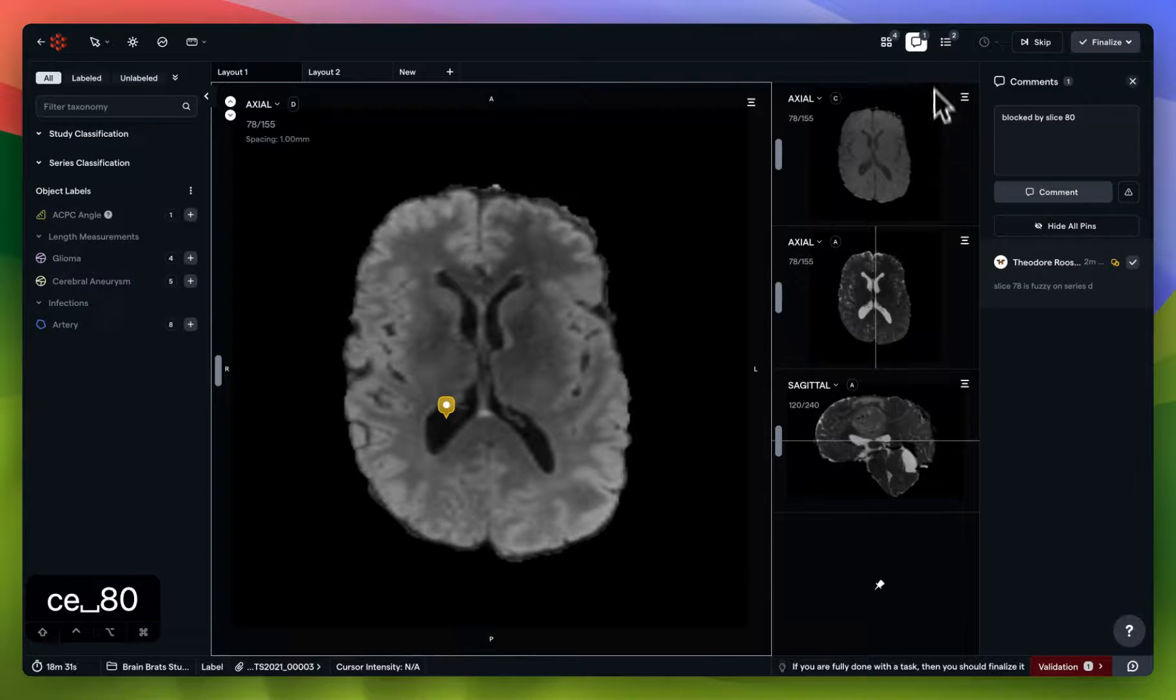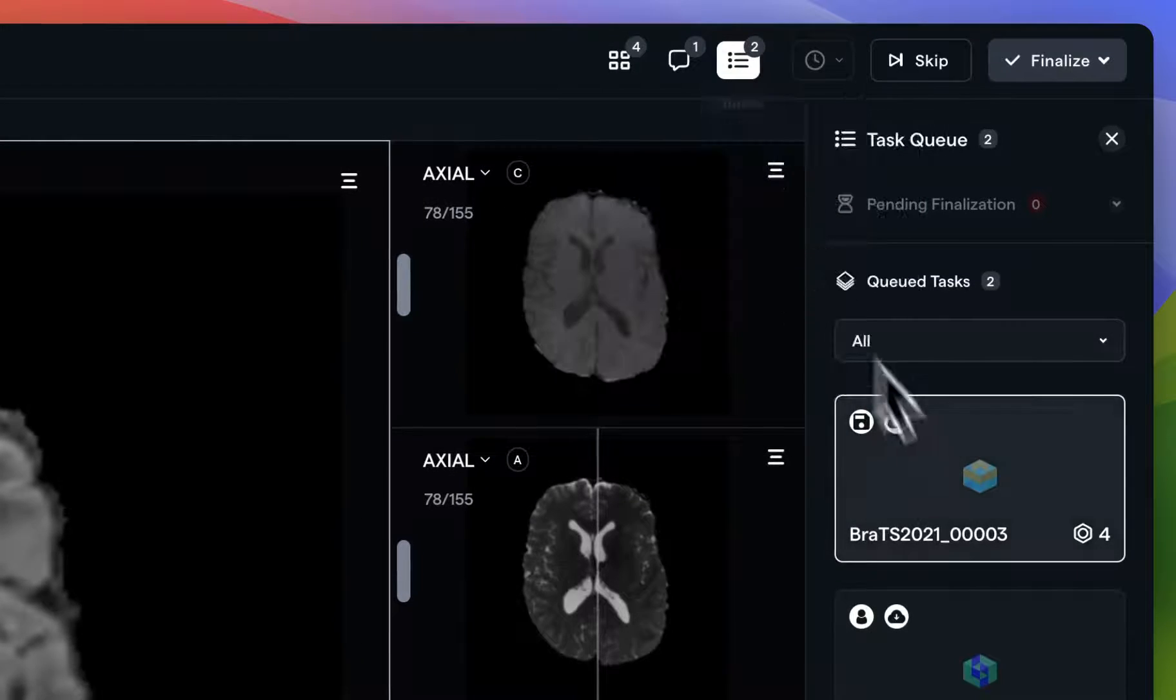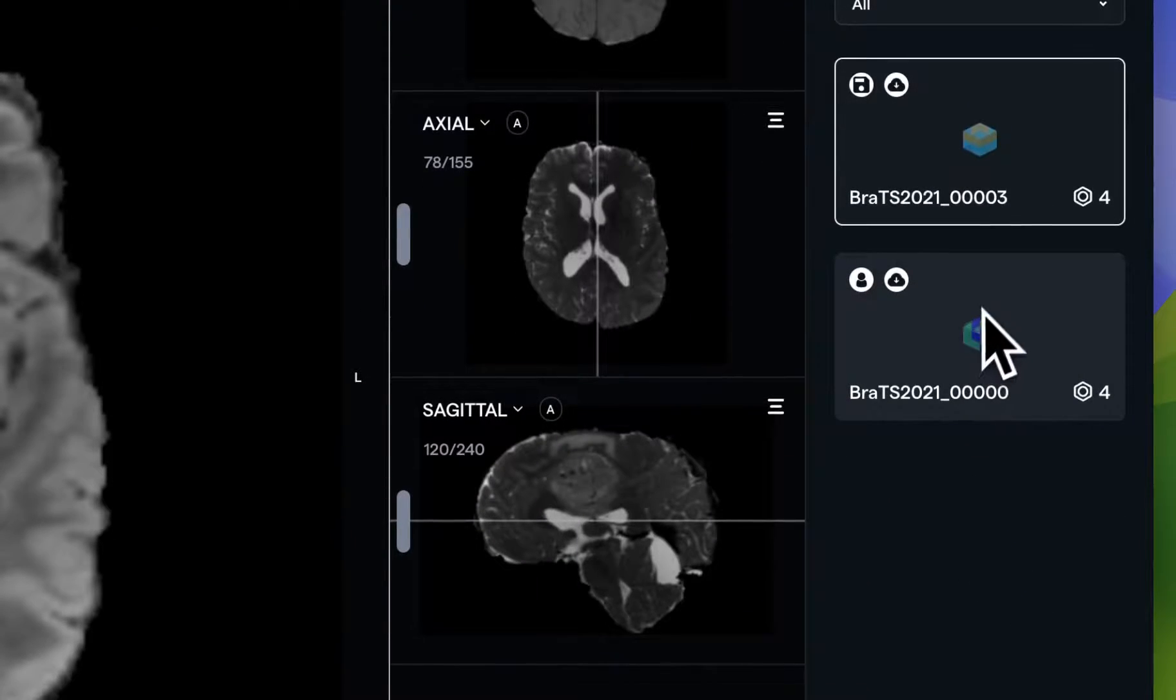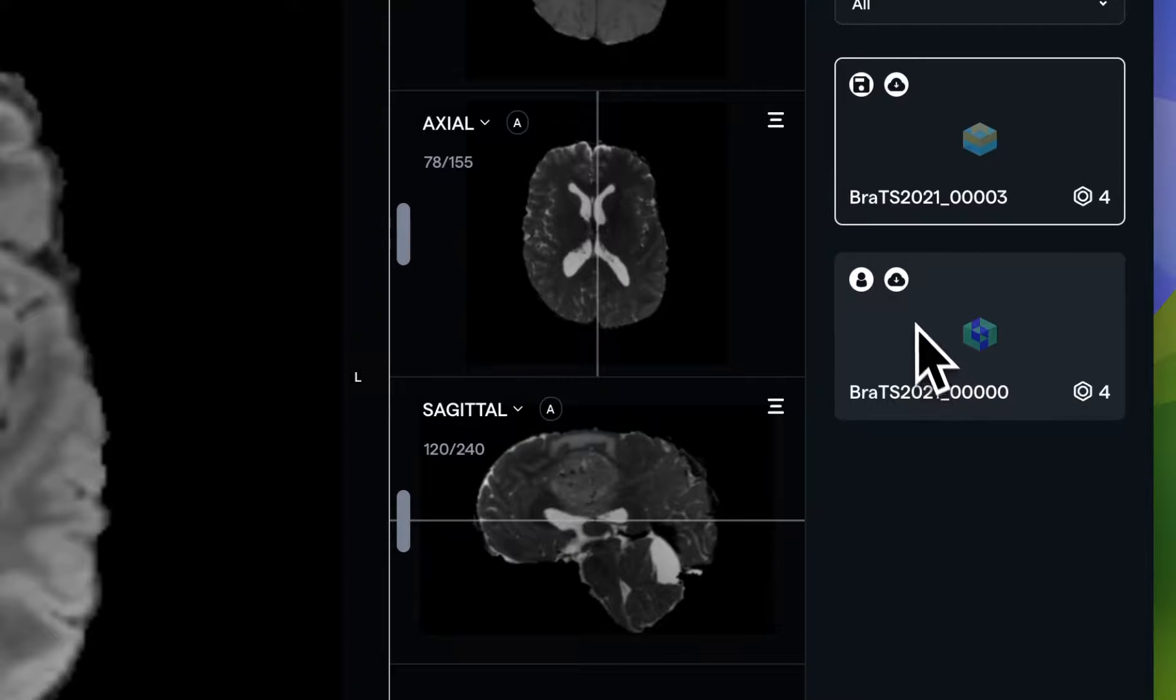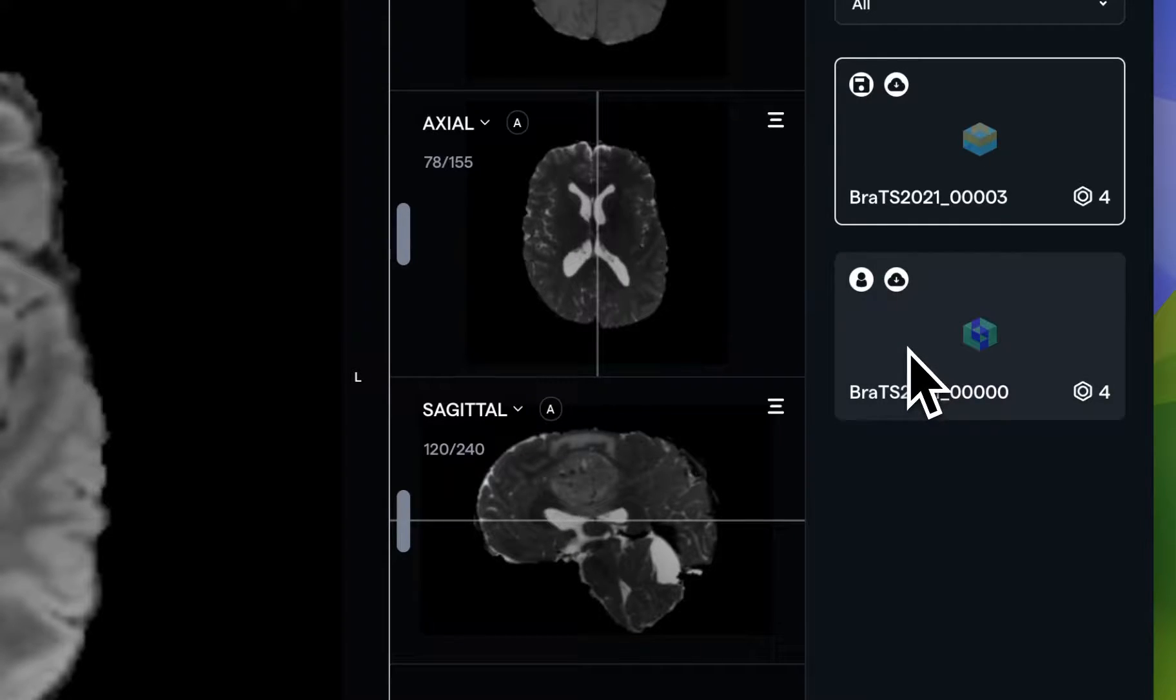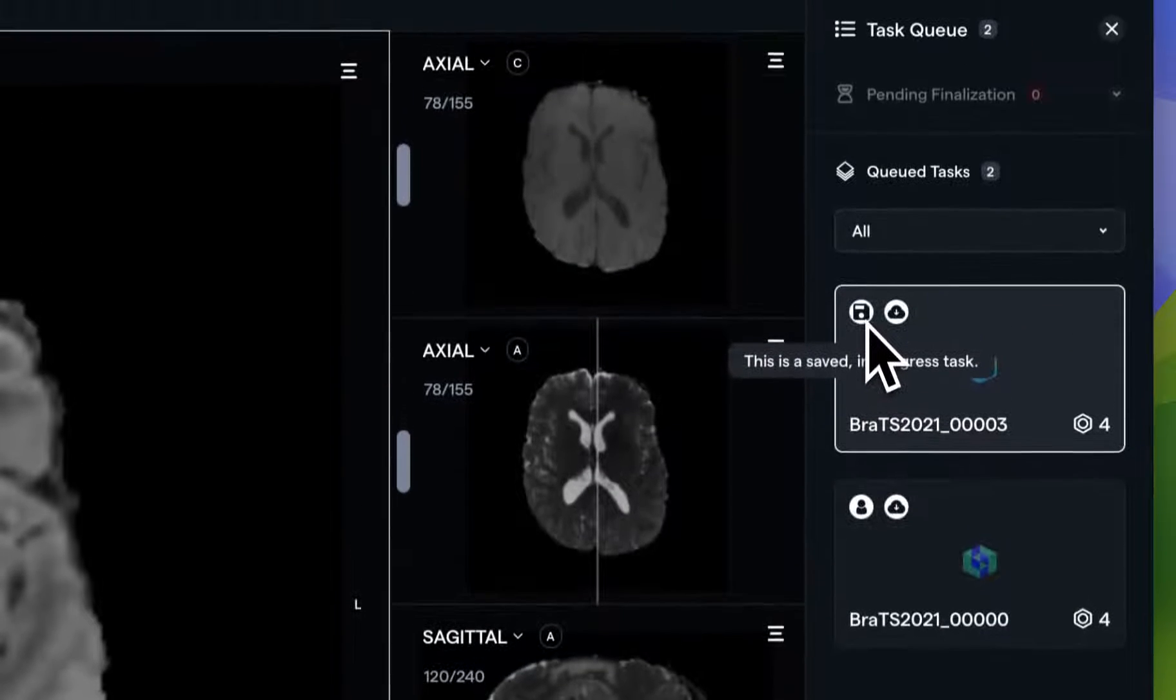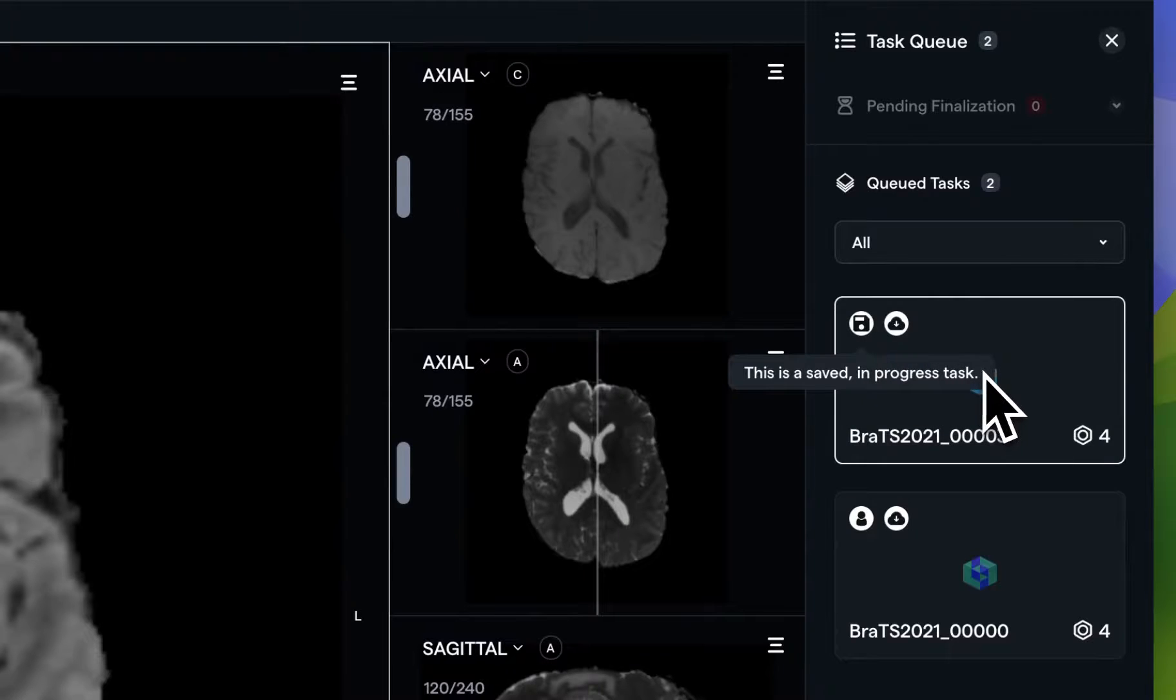Speaking of your queue, the next button here displays a list of the tasks that you currently have assigned to you, as well as some helpful icons for each, such as displaying which tasks have auto-cached already, which tasks are assigned to you, which tasks are in progress, and much more.